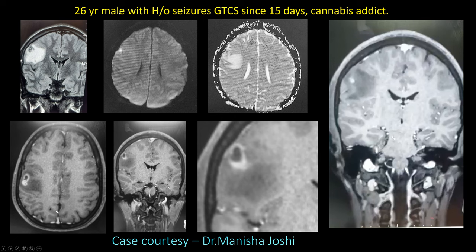First case: 26-year-old male with history of seizures, GTCS since 15 days, and cannabis addict. There is a T2 hyperintense ring-like lesion with perilesional vasogenic edema noted in the right superior frontoparietal convexity. There is restricted diffusion on DWI with the core being low on ADC. On IV contrast, conglomerate ring enhancing lesions are noted in the right superior frontoparietal convexity.